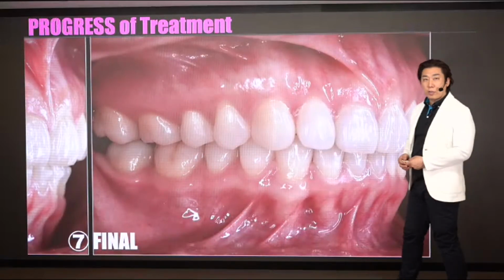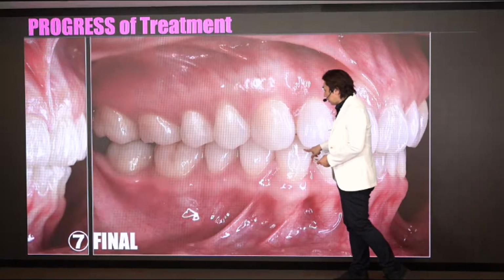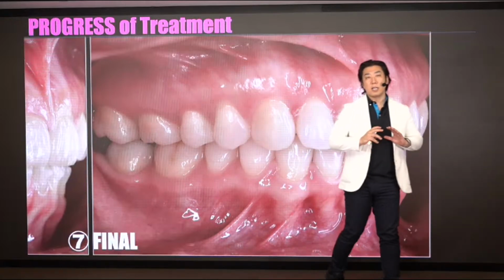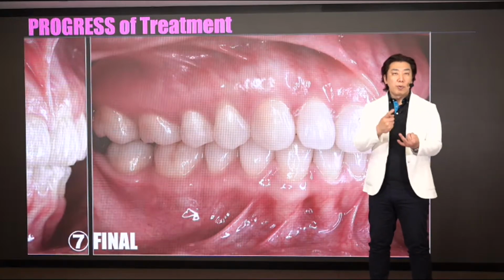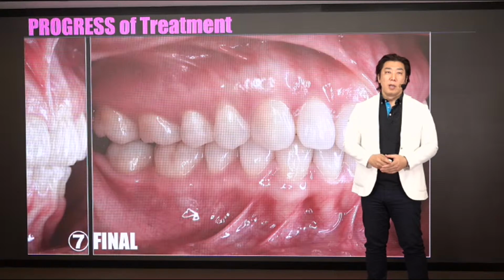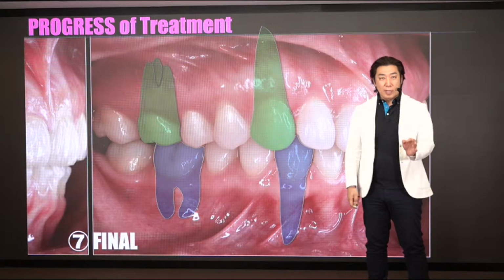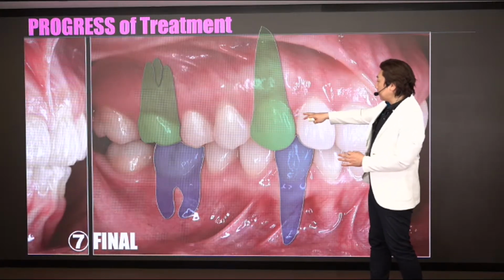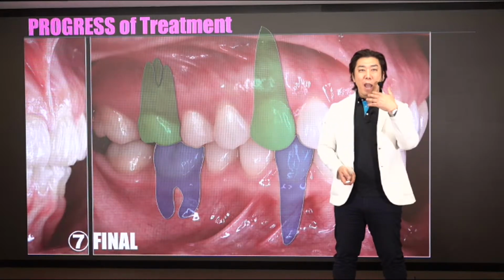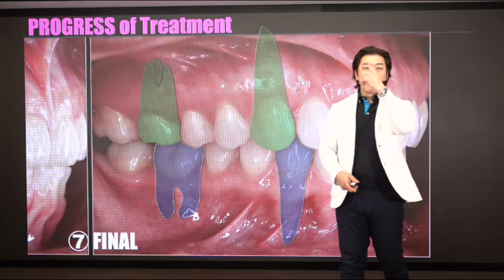Then here is the final situation. Finally, we achieve the anterior guide. The canine guidance is class 1. Class 1 relationship, the molar side, everything. No need for any TAD, only alignment, elastics, planning, thinking about the joint, function, and muscle only. Tooth alignment is done. Anterior guide is done, improved. The molar contact, everything is completely perfect, but the very important thing is the smile, because the patient's focus and main interest is a beautiful smile.